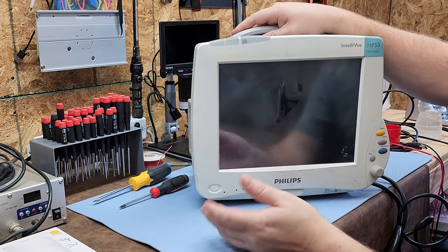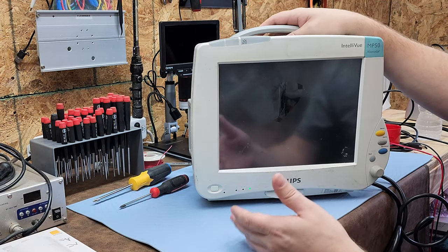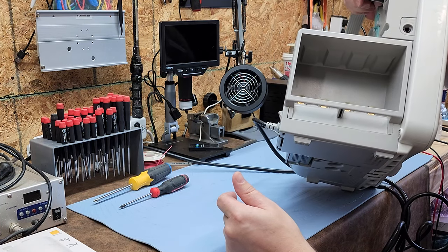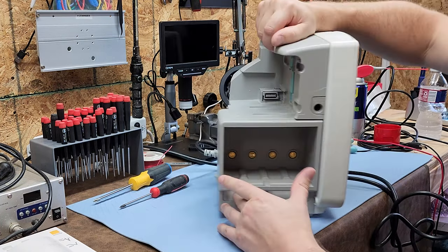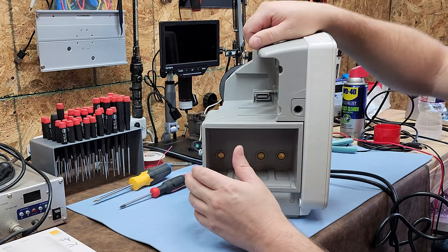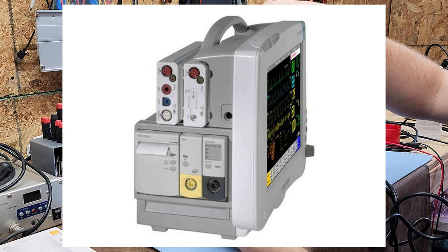The MP50 is a patient monitor that can hold a variety of functions — it can be a bedside monitor or a transport monitor. This is an interesting variety of the MP50 because it has module slots right here for bricks. You can have a printer dock in here, or various expansion options.